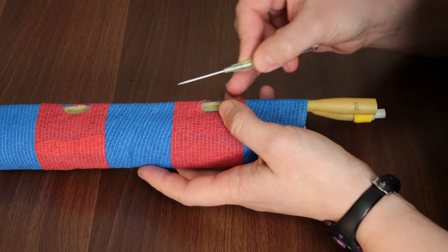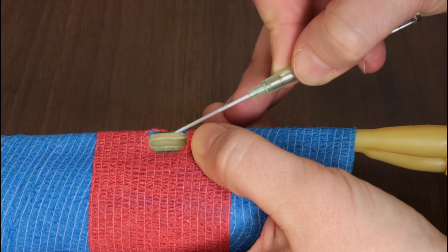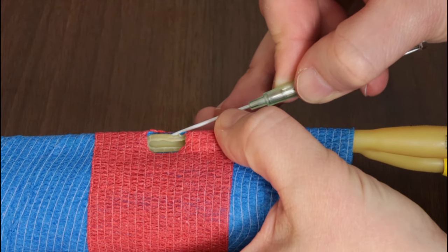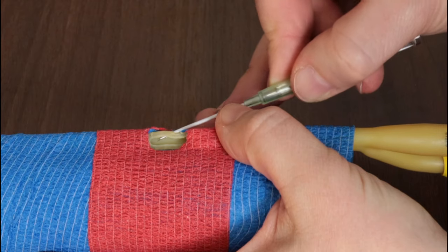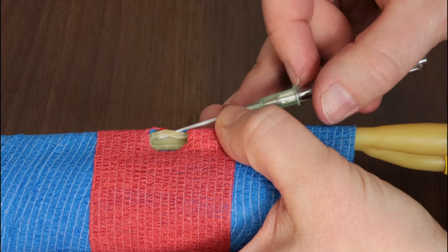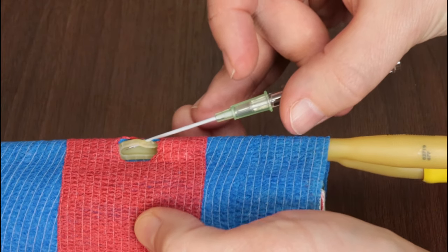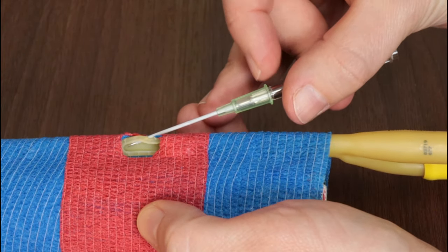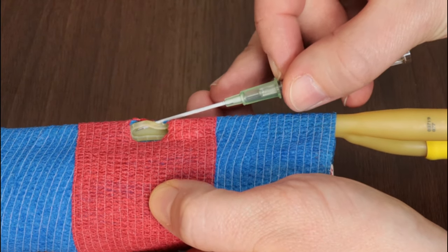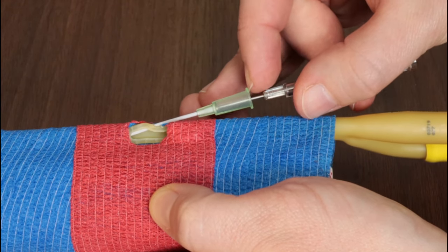Then let me just finish by quickly going ahead and placing this catheter in on a window so you can see. So I had my beveled edge up. We advance until our catheter is in place here. So I dropped my angle, advanced a little bit further. Note that I have my driving fingers on my stylet and they are parked. And my forefinger is running my tabs and he's going to advance my catheter off of my stylet.